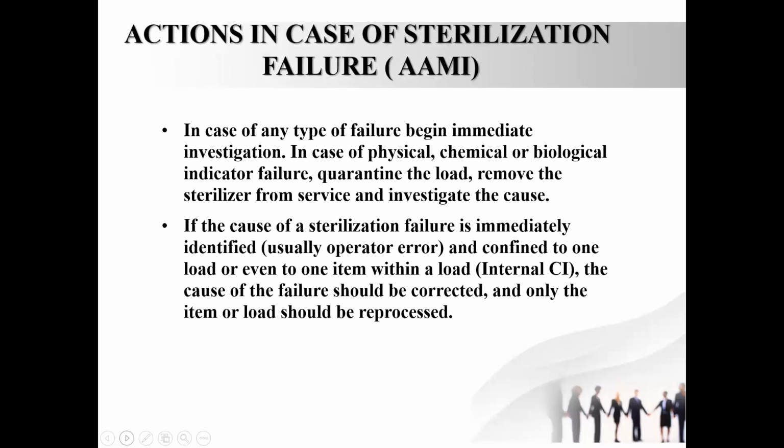So according to AAMI, I hope you all know AAMI, the Association for the Advancement of Medical Instrumentation. You can Google it and find out what AAMI is. They lay down guidelines for steam sterilization for hospitals. So according to them, as soon as you feel there is a failure, you have to begin investigation.